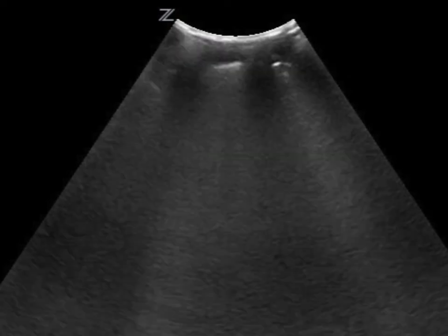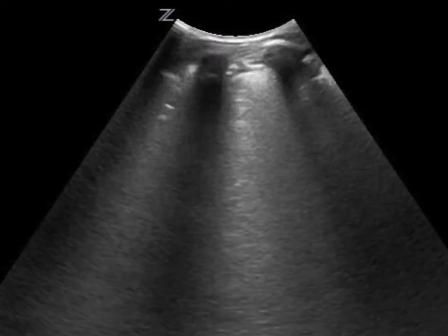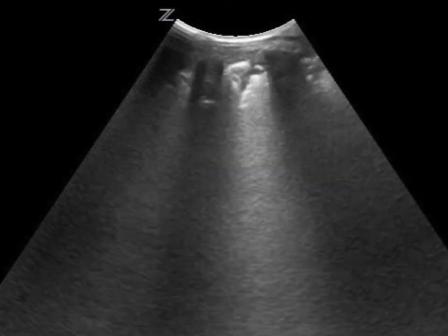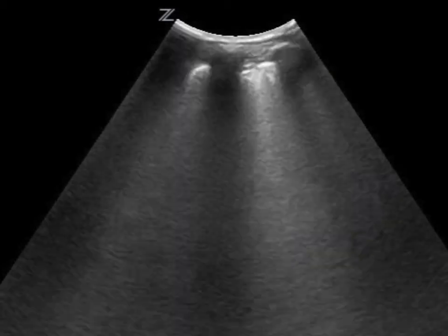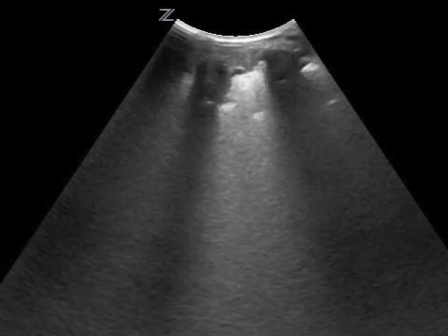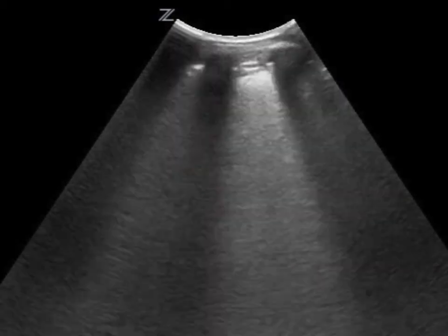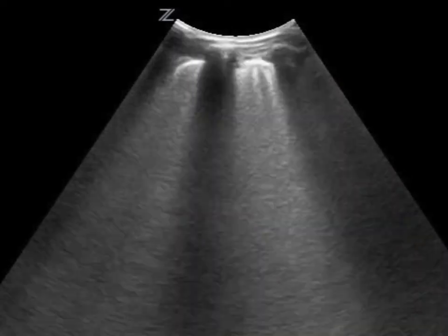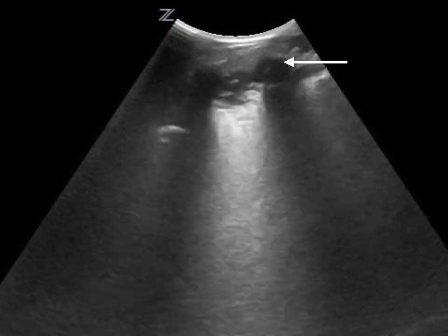Okay, so surprise, surprise, we're looking at another lung. Let's go through that. We've got some B lines in this case. We can see these bright white lines starting at the pleural line. They're going off the screen. I'm not seeing any A lines, which means if I'm perpendicular, I must be erasing them. But in addition to that, the next thing we can ask is, well, do I have a straight and crisp pleural line where the visceral and parietal pleura are meeting?